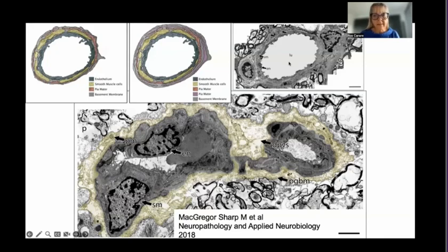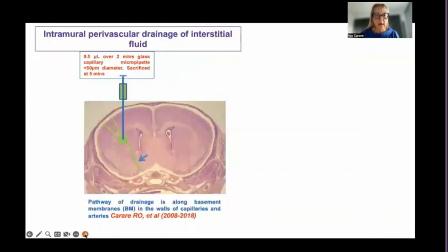On the right-hand side, you can see these two layers without them being colored in, and we know we're in the white matter because we can see the myelin sheaths. These are all specimens from very carefully preserved human tissue after biopsy.